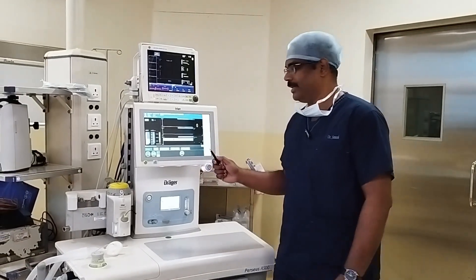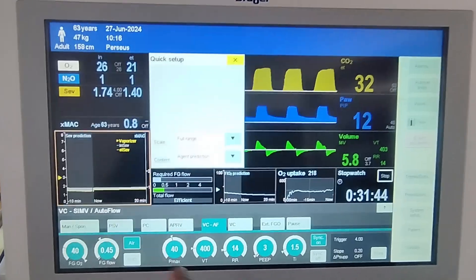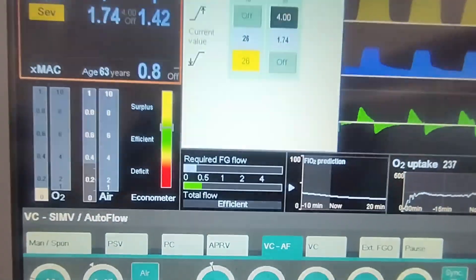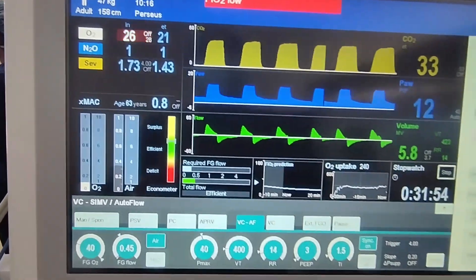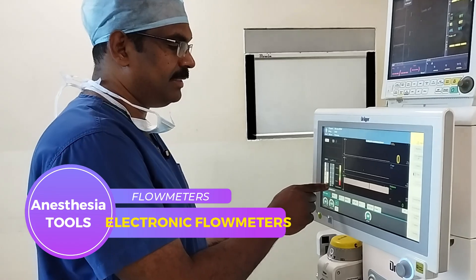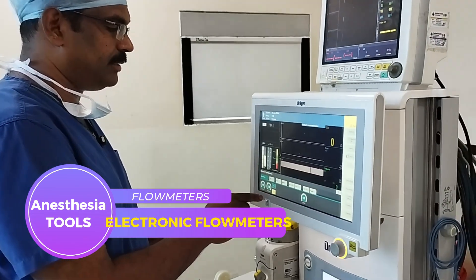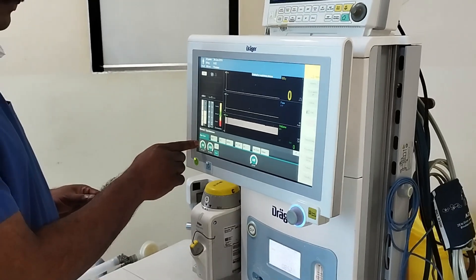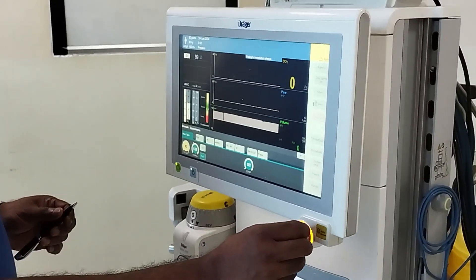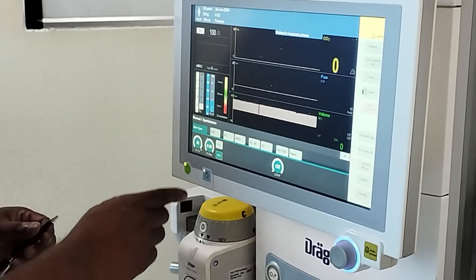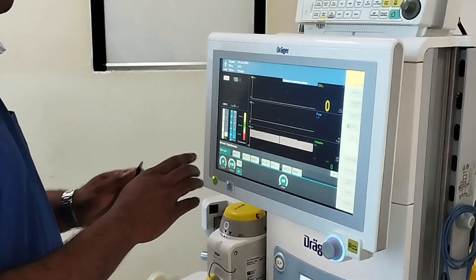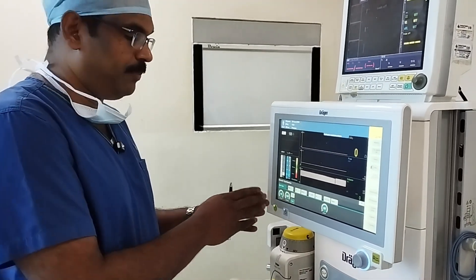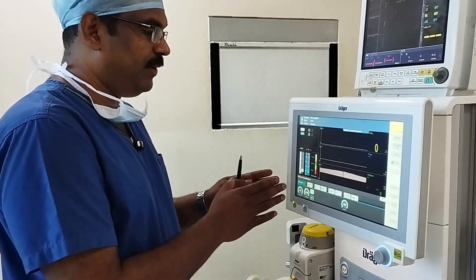This is a Dräger Perseus machine where you can find electronic flow meters. Because there is electronic gas mixing, we don't have separate knobs to control oxygen, air, or nitrous oxide. The flow meter shown here is a virtual flow meter which displays oxygen and the second agent — either air or nitrous oxide — as we choose. What we actually do is set the percentage of oxygen: if I set 40% oxygen, the corresponding nitrous oxide is automatically dialed by the software, so we need not adjust two different flow meters manually. This is an example of a virtual flow meter.